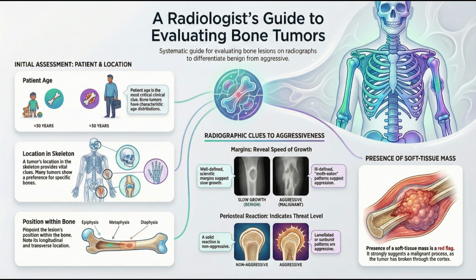Matrix analysis tells us if the tumor is bone-forming, cartilaginous, or fibrous. If you see an osteoid matrix, it indicates a bone-forming tumor. And what does that look like? Visually, it's fluffy, amorphous, kind of cloud-like, dense mineralization just floating within the lesion. This is the signature of aggressive bone tumors like osteosarcomas, or benign ones like an osteoid osteoma.